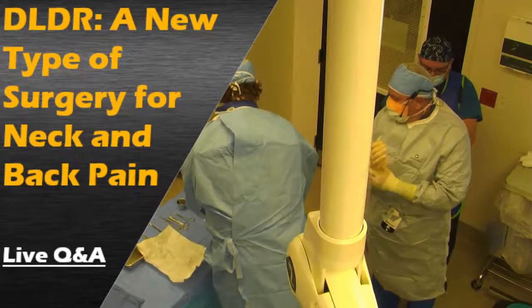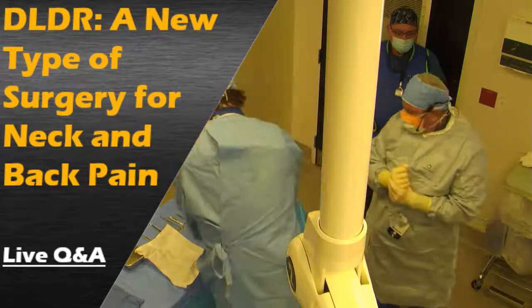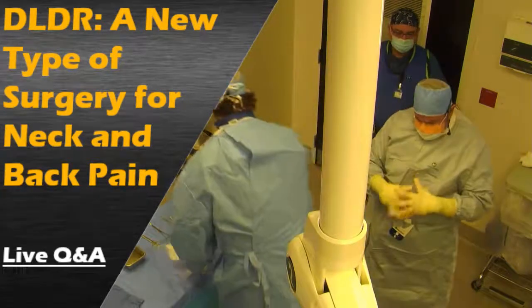Okay, so we're two weeks away from Halloween, it's 2020, the COVID-19 year. We're here at Duke Spine Institute getting ready to perform a Duke Laser Disc Repair, which is endoscopic spine surgery.